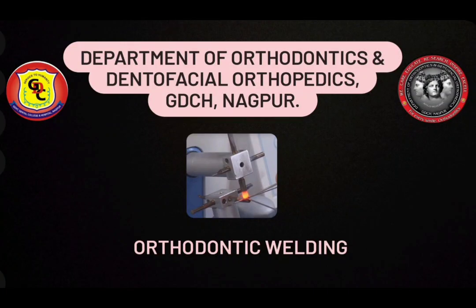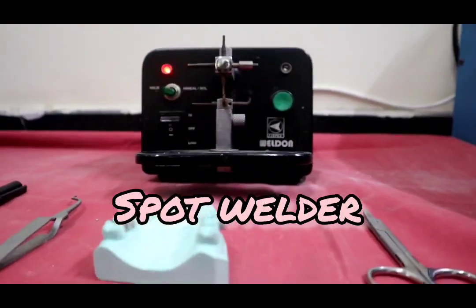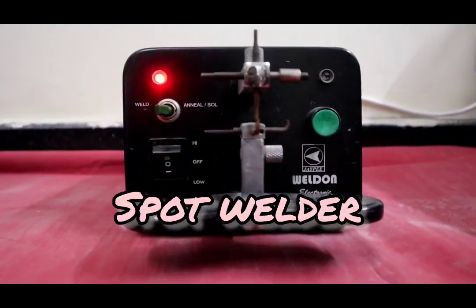Department of Orthodontics and Dentofacial Orthopedics, GDCH Nagpur, presents a video on orthodontic welding. Welding is the joining of two metals directly without intermediate filler material. This is achieved by use of heat and pressure. This is a spot welder.